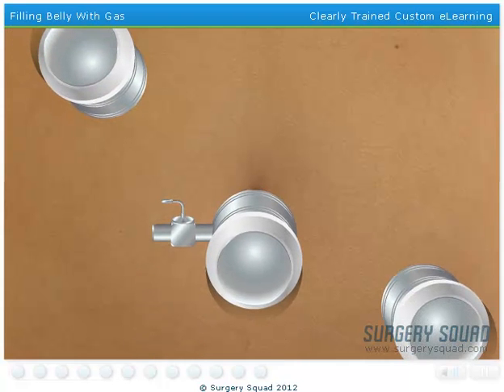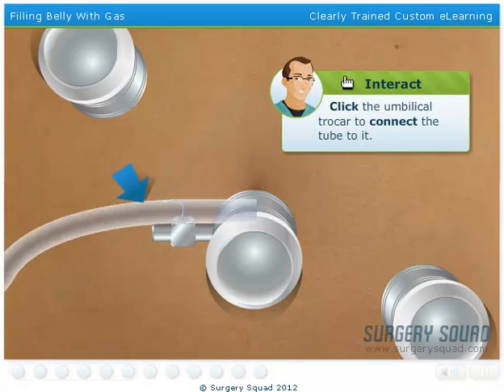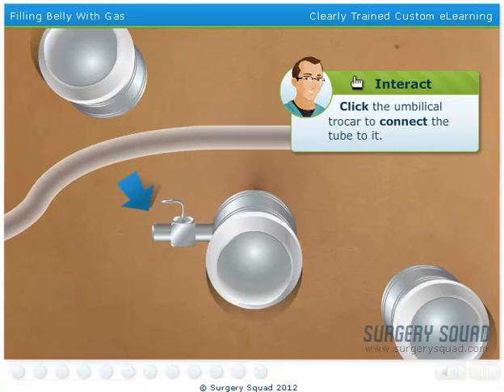Now we need to pump carbon dioxide gas into the patient's abdomen to obtain a better look at the surgical area.